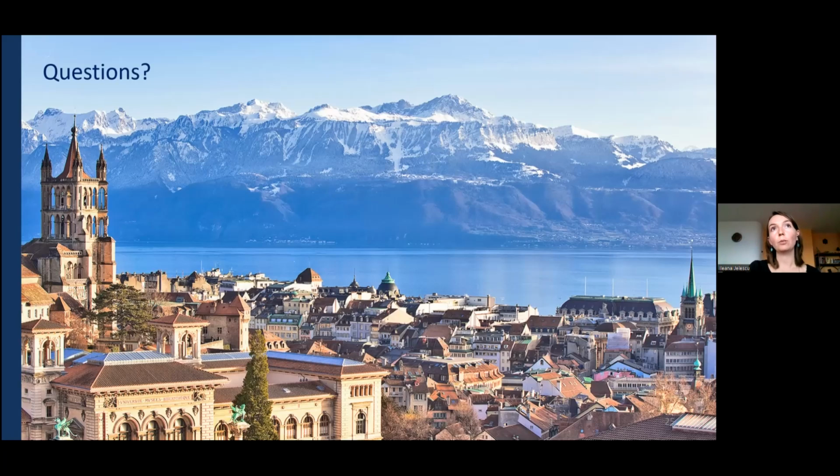And this helps you, so combining linear diffusion encoding measurement with another measurement of spherical diffusion encoding, for example, helps you disentangle the so-called microscopic anisotropy. So you would have different measurements from sticks that are randomly oriented versus spheres that are, well, of course, randomly oriented, but this helps you disentangle the microstructure features much better. Yeah. I don't know if that was clear enough.